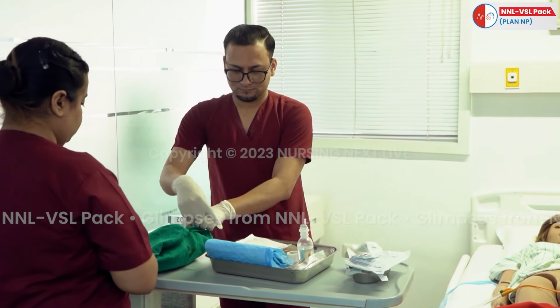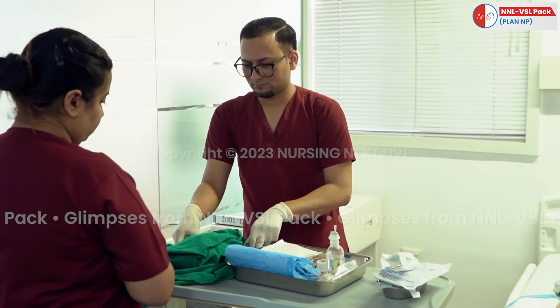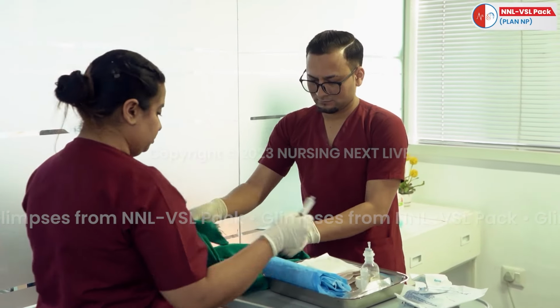Assistant nurse will pour the sterile gauze pieces in the sterile field and fill the bowl with normal saline.